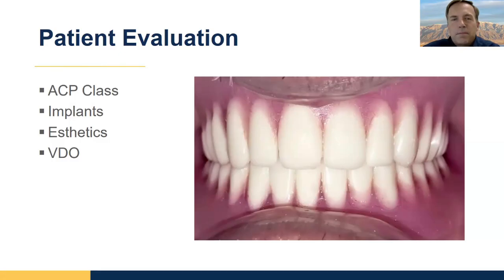Oh, this is a good question. How would you add the fabrication data to a patient file? Those files are relatively large unless we only talk about the STL file. What I would say about that is that I would only save the STL files of the base and the denture teeth. And if it was done in exocad, then I'd save the construction file too. Those three files, I email them a lot around our company, and usually I'm under 35 megs for the whole set.